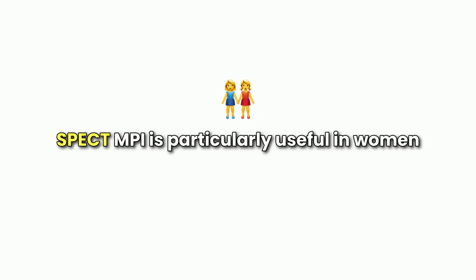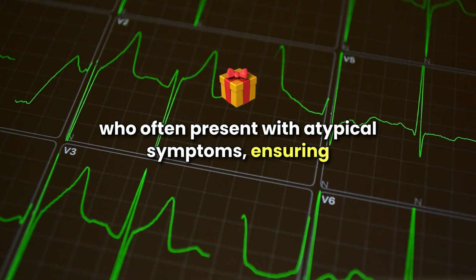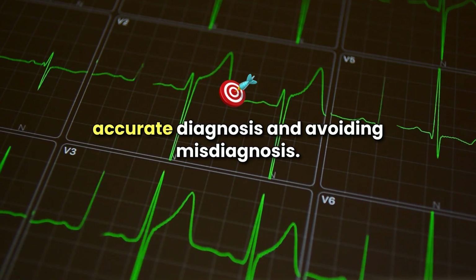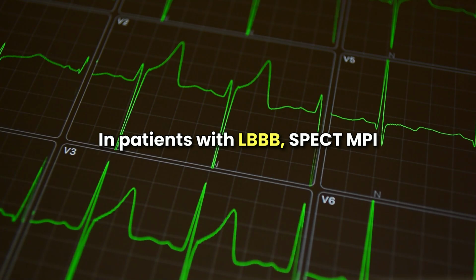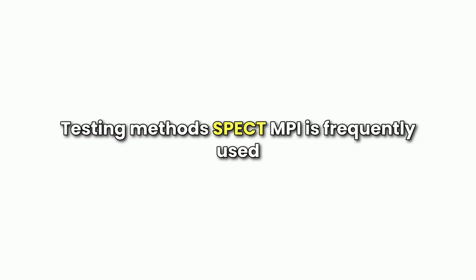SPECT MPI is particularly useful in women, who often present with atypical symptoms, ensuring accurate diagnosis and avoiding misdiagnosis. In patients with LBBB, SPECT MPI helps clarify perfusion abnormalities that are difficult to assess with other stress testing methods.